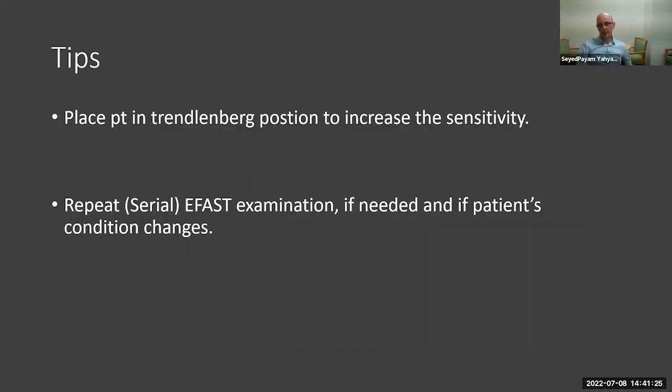Now, to increase the sensitivity of the ultrasound in trauma to pick up fluids, for the upper parts of the abdomen, in the right upper quadrant and the left upper quadrant, we put the patient in the Trendelenburg position with the head down, and for the pelvis, reverse Trendelenburg. And the good thing about EFAST is that it's non-invasive, no radiation to the patient, so we can repeat it, especially if the hemodynamic or other clinical features of the patient change.